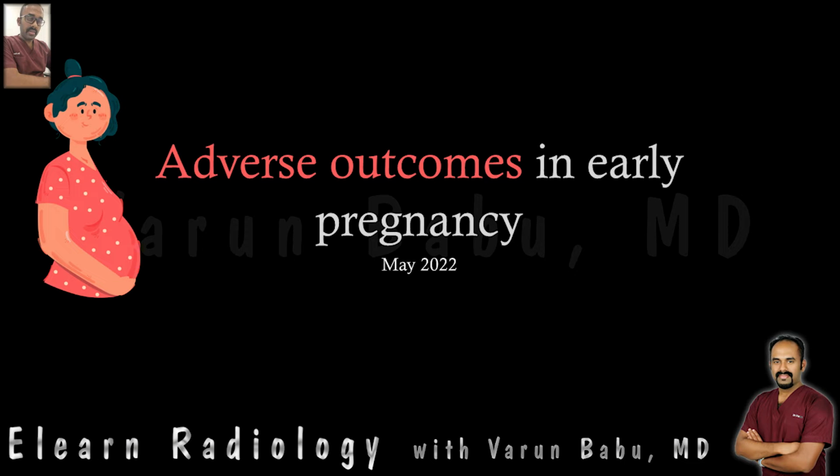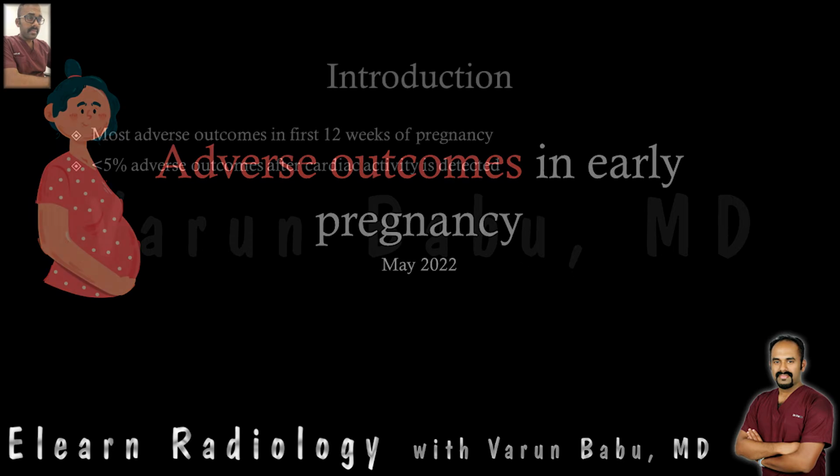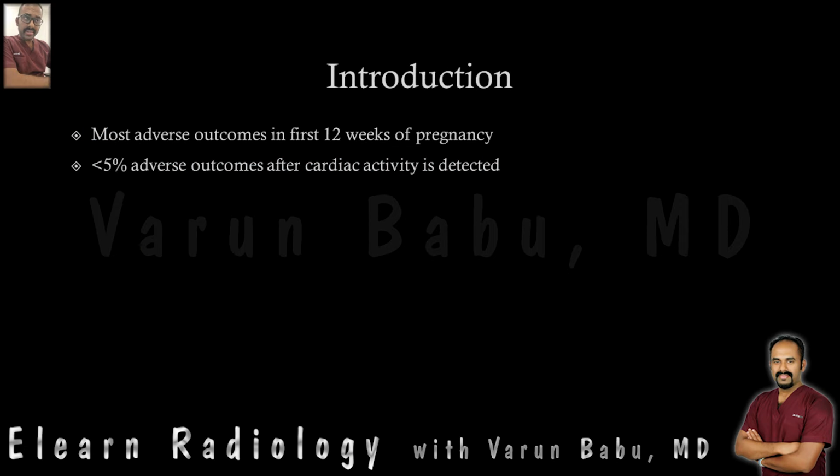Let's have a look at adverse outcomes in early pregnancy. Most of the adverse outcomes occur in the first 12 weeks of pregnancy. Less than 5% of the adverse outcomes occur after cardiac activity is detected. So essentially, most of the adverse outcomes occur when no fetal cardiac activity is detected.